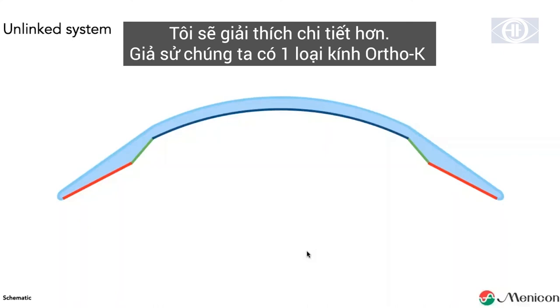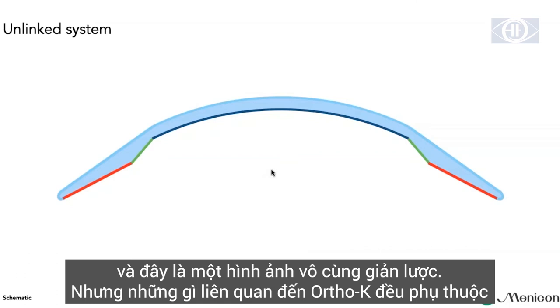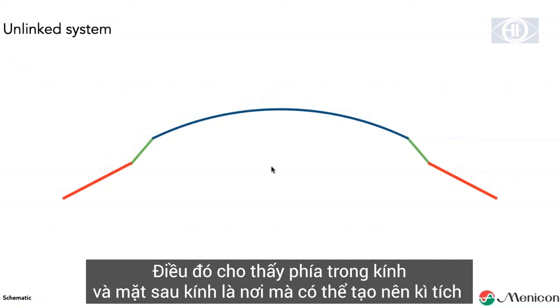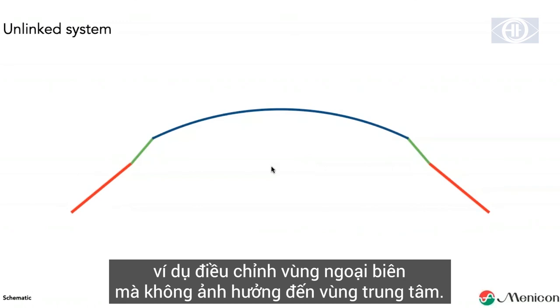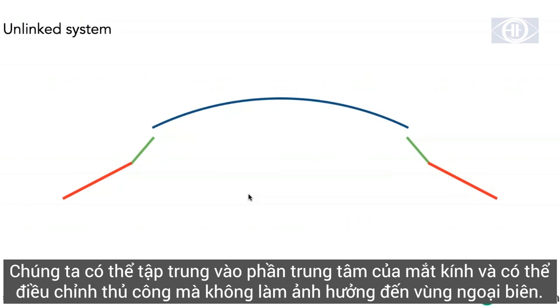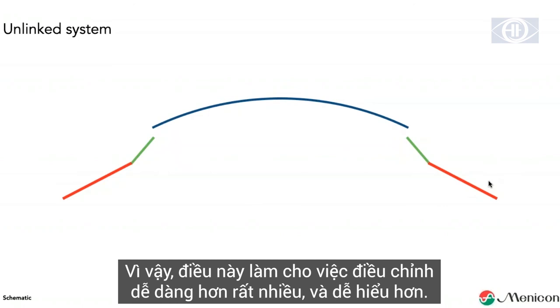So if we have a kind of ortho K lens, and this is a very schematic image, with an ortho K lens everything depends on the backside of the lens. So we forget the front side of the lens, it's about the inside, the backside of the lens. That's where the magic happens. And at the moment we have an unlinked system, we can adjust, let's say, the periphery separately from the center. So if we have the fit in the periphery perfect, then we are done with our fit. We can concentrate just on the center of the lens and adjust it manually without affecting the periphery. So it makes the way we fit much easier and much better to understand.